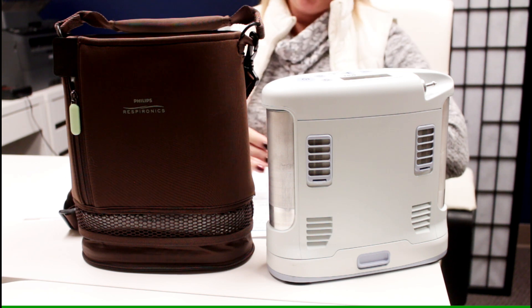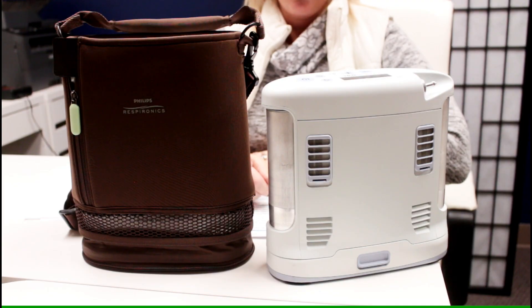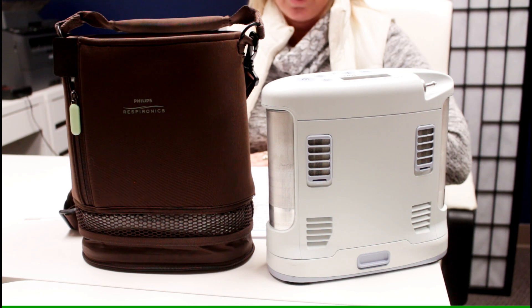Depending on where you live, what is the storage temperature of your oxygen concentrator? Due to the delicate nature of concentrators, you should be aware of the recommended humidity ranges for storing your oxygen concentrator.